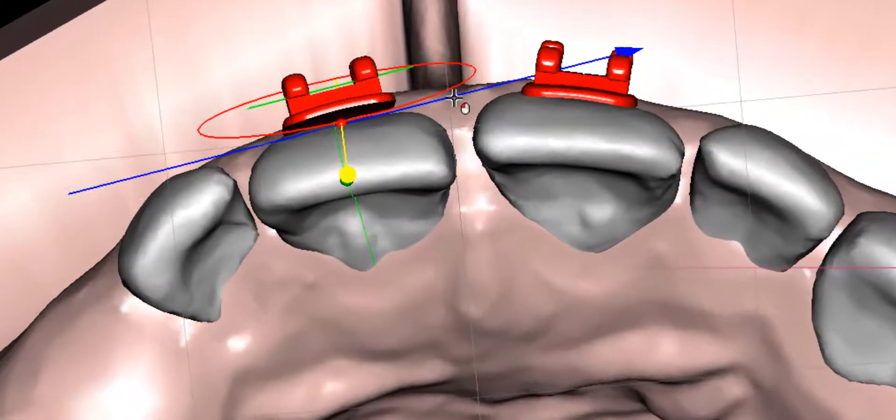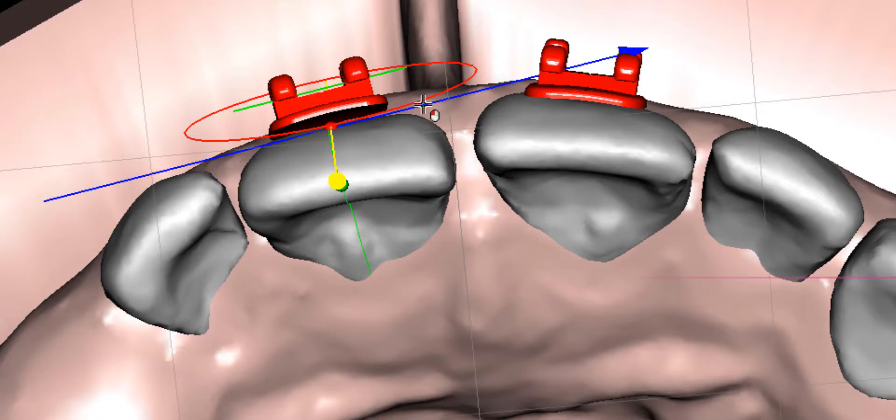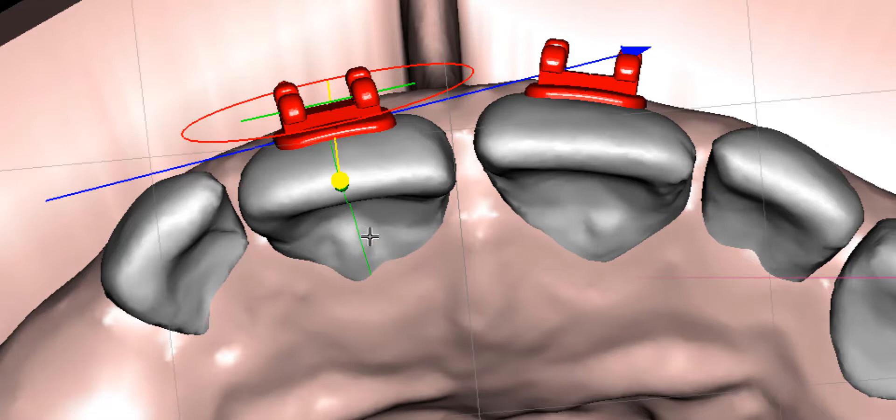A little red dot on the green line. You also need to mark a green line that segments the tooth in half to ensure that you put the bracket at the right position.